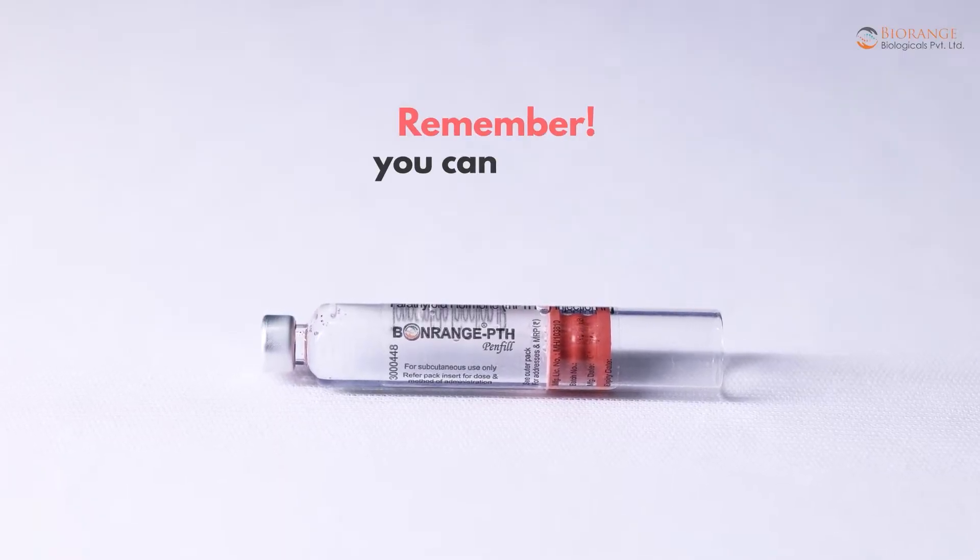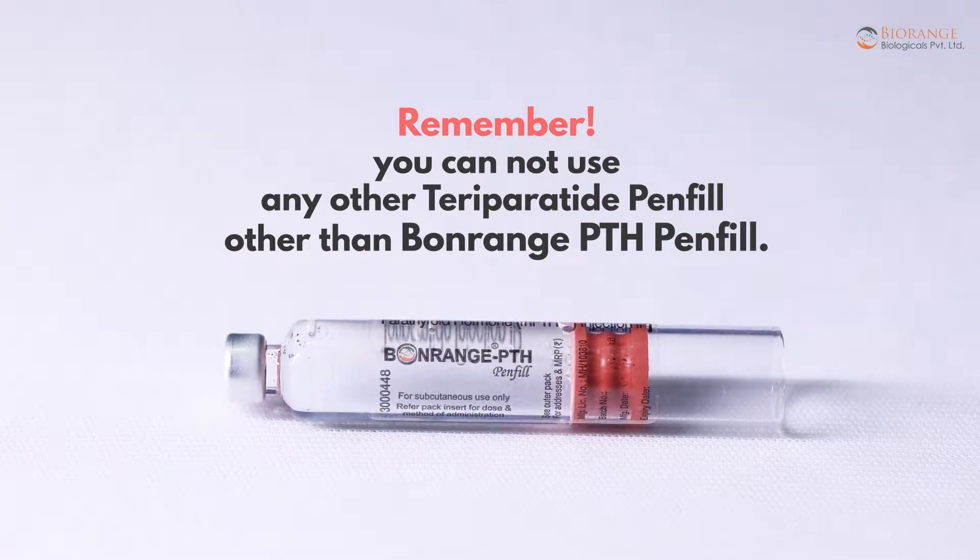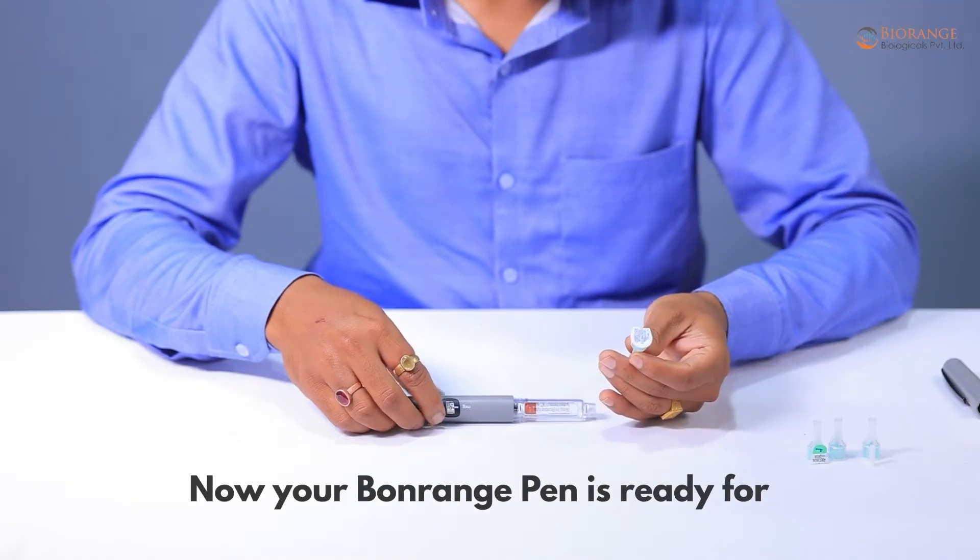Remember, you cannot use any other teriparatide pen fill other than the Bonrange PTH pen fill. Now your Bonrange Pen is ready for needle attachment.